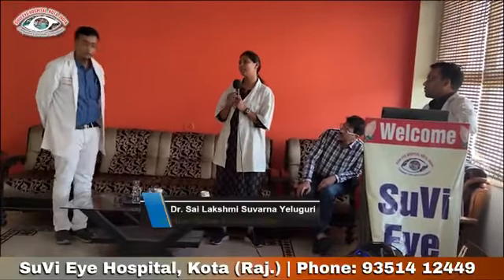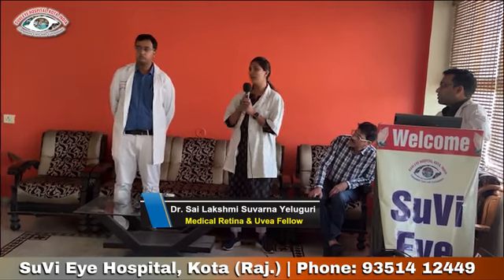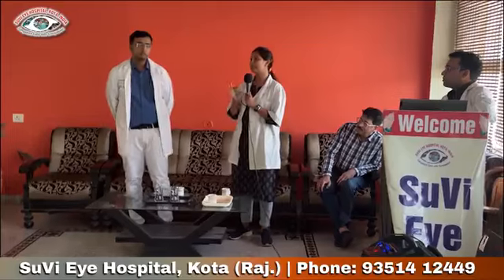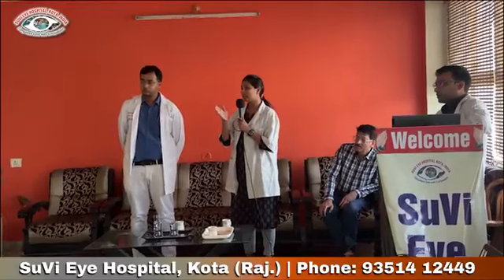And usually when PDR is there, we'll go for PRP, usually in 3 settings. In the first setting, usually we'll cover the inferior quadrant and the nasal quadrant, because sometimes after lasers a vitreous hemorrhage can happen and it can obscure the inferior quadrant. So first it is preferable to do the inferior quadrant. And in case of vitreous hemorrhage where the inferior quadrant is involved, then we can go with the superior quadrant and the temporal, based on where it is visible.